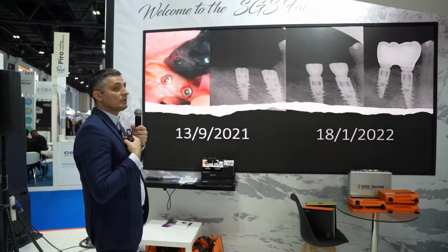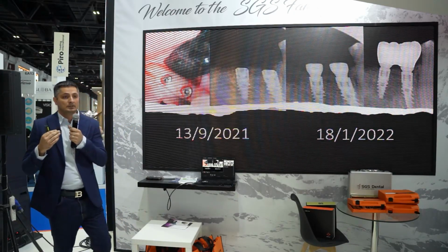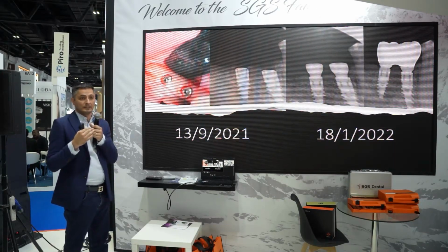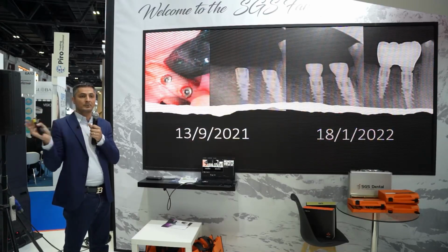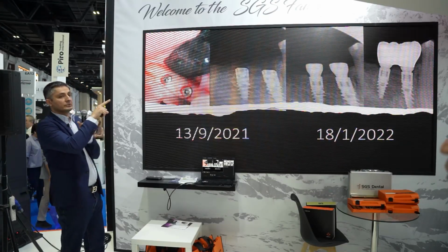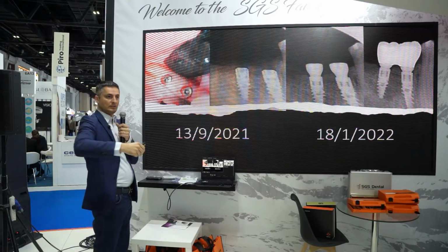Till now, for me, it's okay because before I was getting a very high bone loss with this kind of implants. Even with other kind of implants, let's say Megagen, they have a big problem now. Okay, so for me this is good. Okay, I will show you some cases for 1 year after.